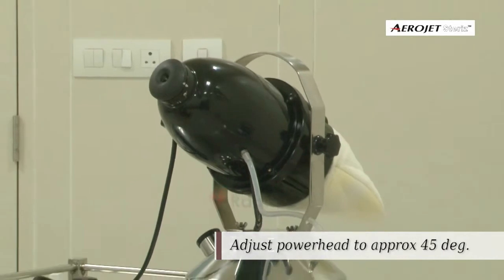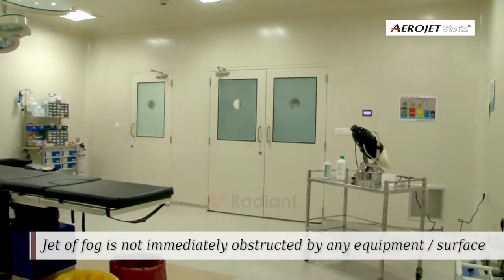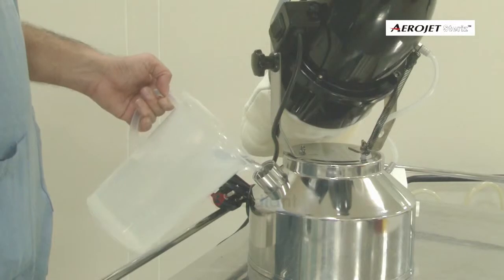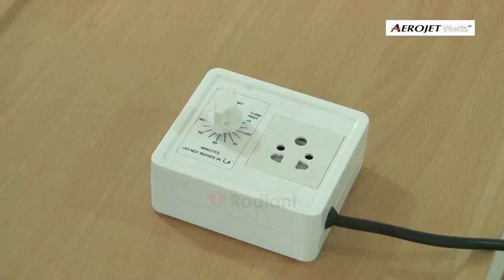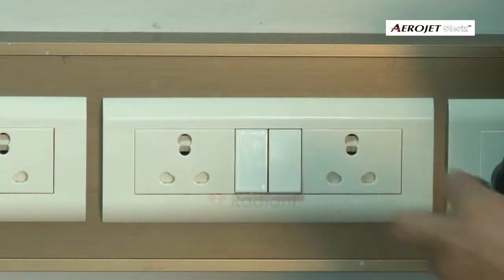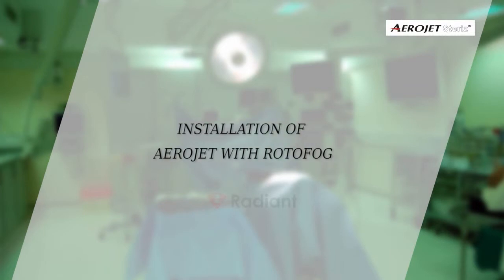Angle the fog jet to approximately 45 degrees of the room. While placing the machine in the room, make sure the jet of fog is not immediately obstructed by any equipment or surface. Fill the measured disinfectant solution into the tank and close the tank lid. Connect the power cable of the machine into the timer socket and the timer cable into the power mains.